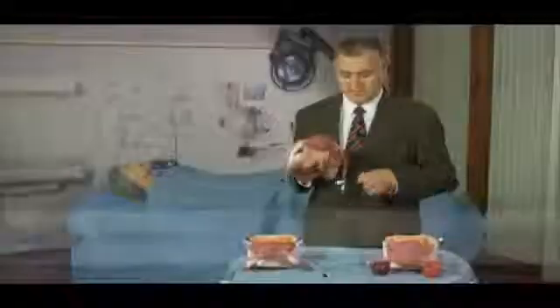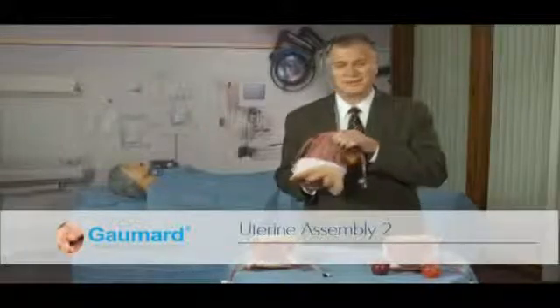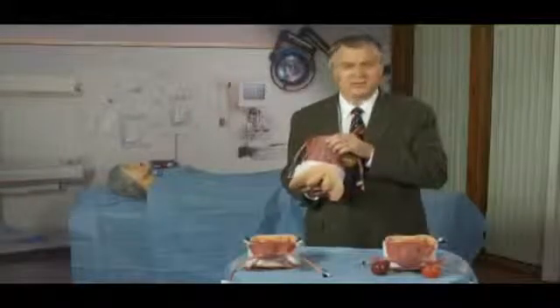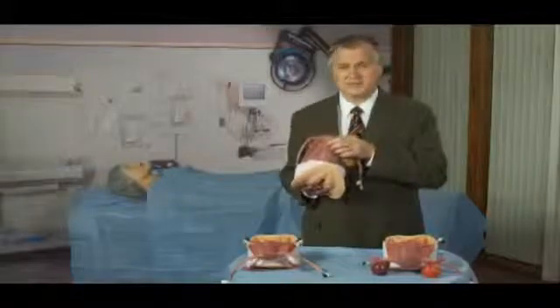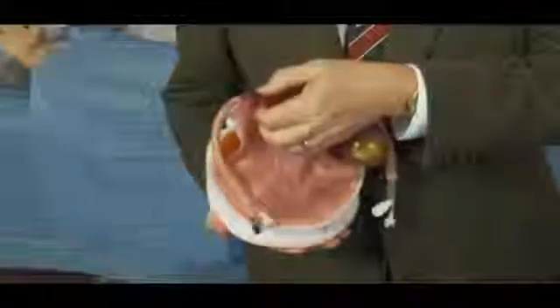Uterine assembly number 2 includes an enlarged uterus. You notice this is bigger than uterine assembly number 1. It has a larger cavity inside. So uterine assembly number 2 can have products of conception placed up inside its cavity so that the learners can perform a suction curettage of the uterus. This uterine assembly also has an ectopic pregnancy.